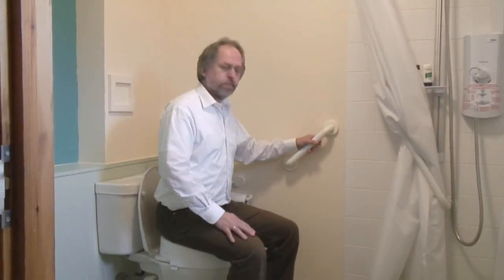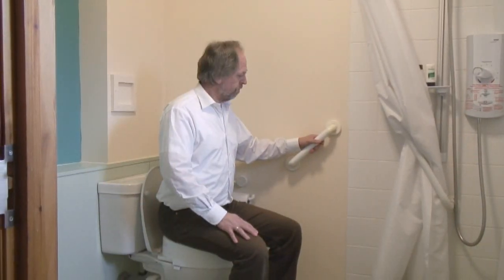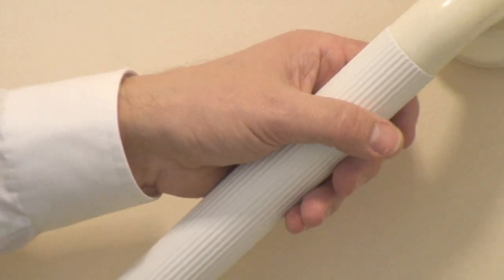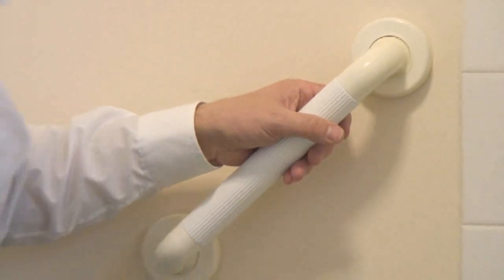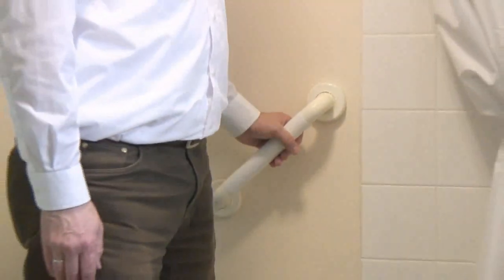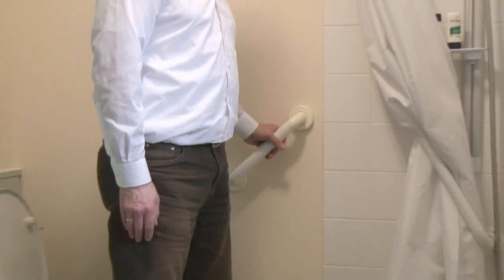You're able to sit down and you've got that rail there now, which as you can see at that position, at that height and particularly at that angle, that rail is still giving you that bit of extra support. If you just want to bring yourself up to a standing position from there, Charles, you can see in that position that rail is supporting you both from the seated position to fully standing.